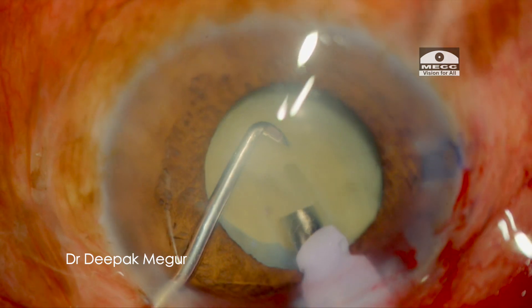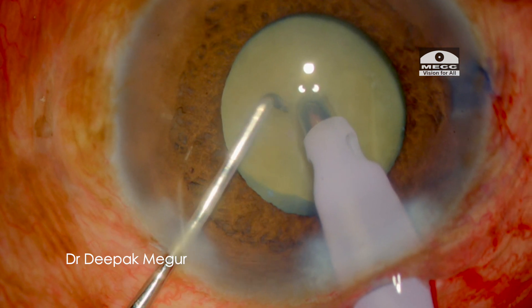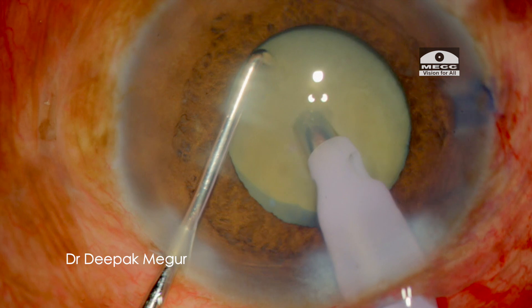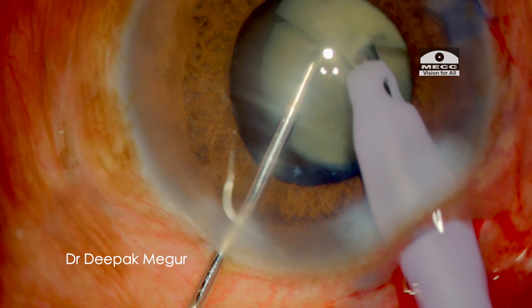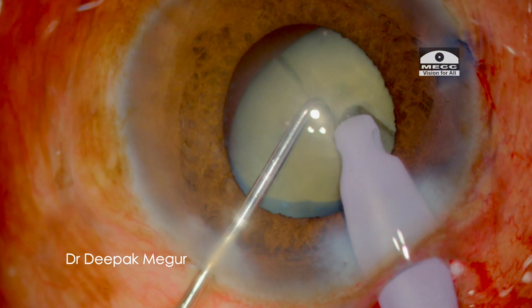The visibility is not so great owing to the lack of corneal clarity. I plan to do a direct vertical chop. The initial grip on the nucleus is not great and it is quite difficult to hold it. After a couple of attempts I am able to bury deeply, and the nucleus could now be easily chopped.